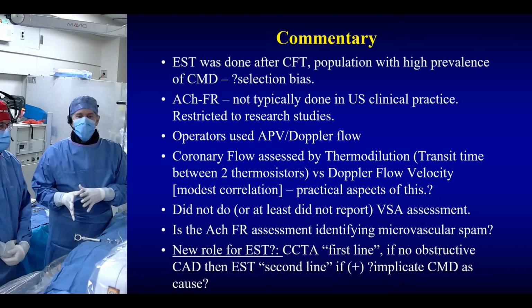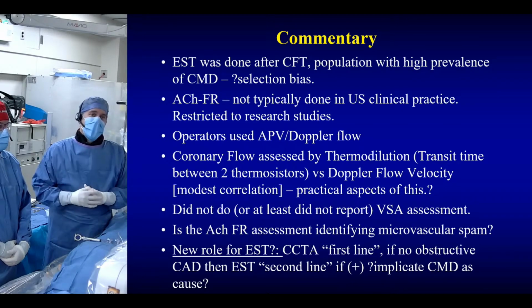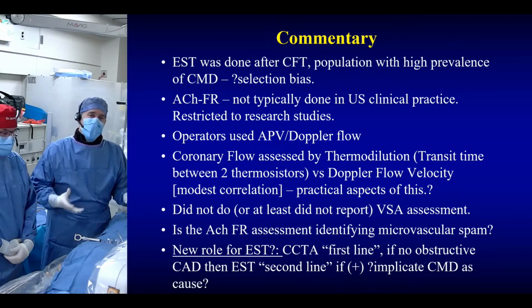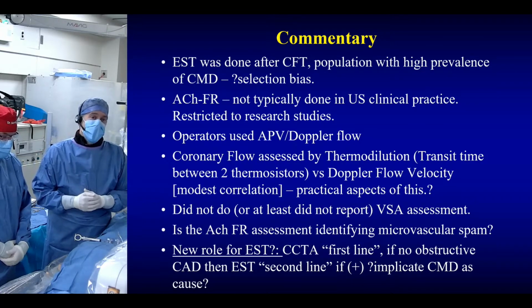And what we've done is moved away from that, moving more towards thermodilutional flow. That's what we'll be doing today with a Cora flow wire. And the aspects of comparing Doppler flow velocity versus thermodilutional is unknown.